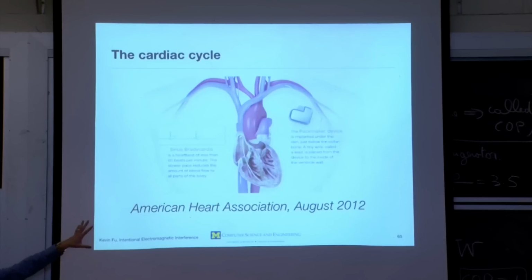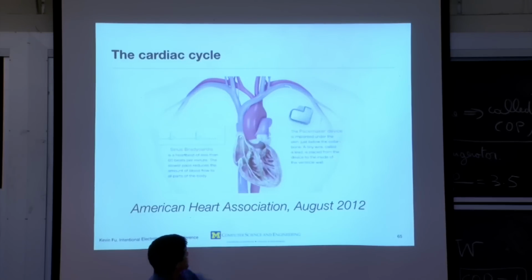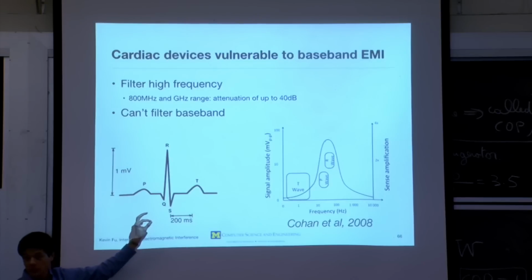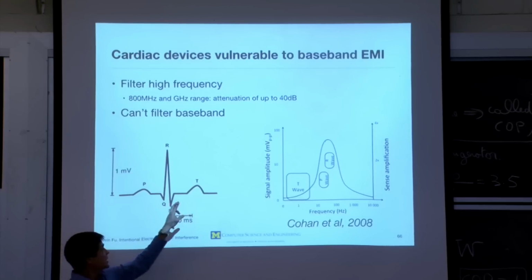So again, the defibrillator is implanted beneath the clavicle, and it has these electrodes. You can kind of see them here that go into the chambers of the heart, and it's used for both sensing and actuation. So it's just a signal. So this is the time domain, and this is the Fourier transform, effectively. This is a single heartbeat, and the heartbeat is actually quite intricate. The physicians have actually labeled the different components of the heart rate. You've got the QRS complex, which is typically what you would think of as the heartbeat. The actual beat is this giant R here. That's the one you'll feel. But there are also these other smaller waves as your tissue is energizing and relaxing.